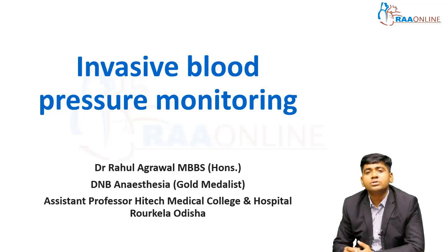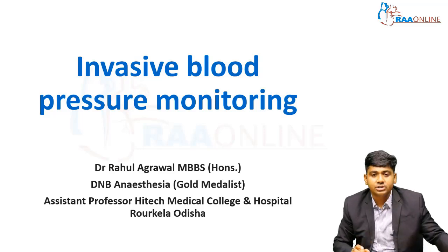There are also prerequisites to put an arterial cannula, like the Allen test and modified Allen test, which we can do before putting an arterial cannula to know the patency of both the radial artery and the ulnar artery. So in this background, let us continue with invasive blood pressure monitoring.